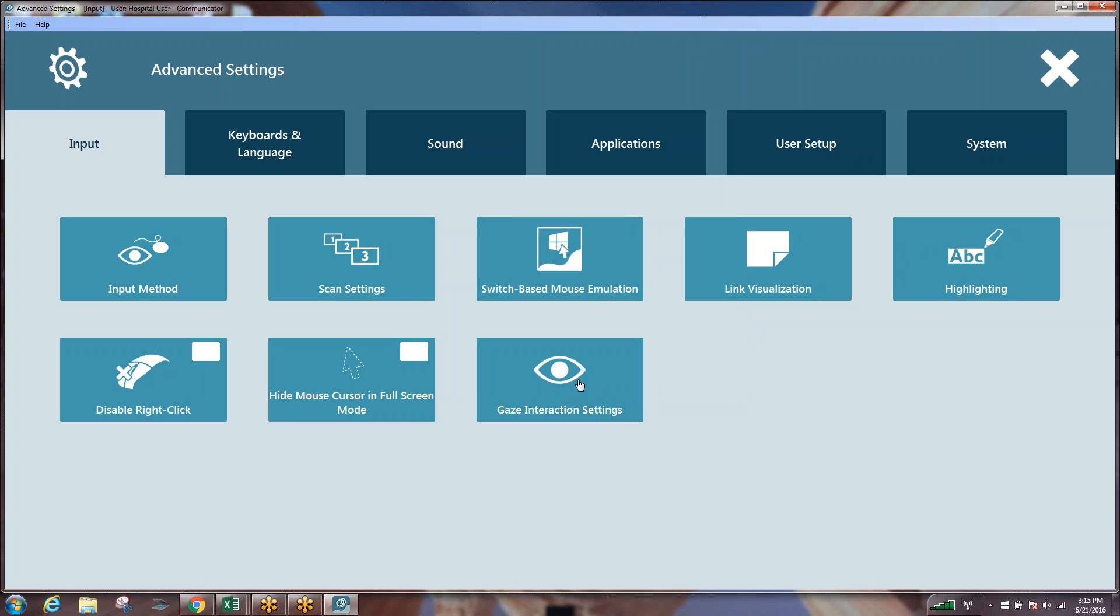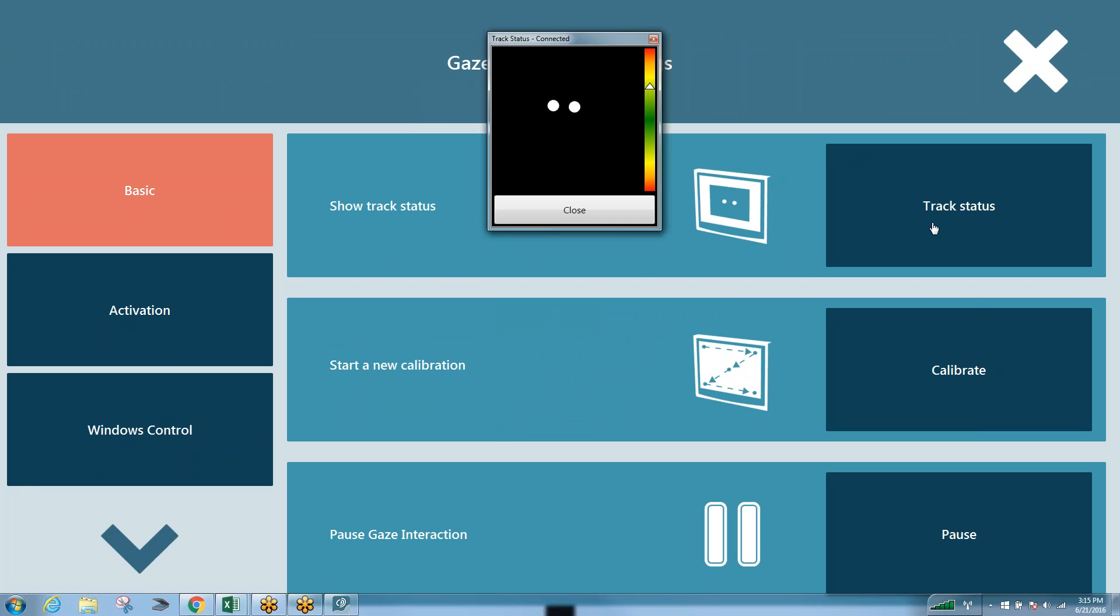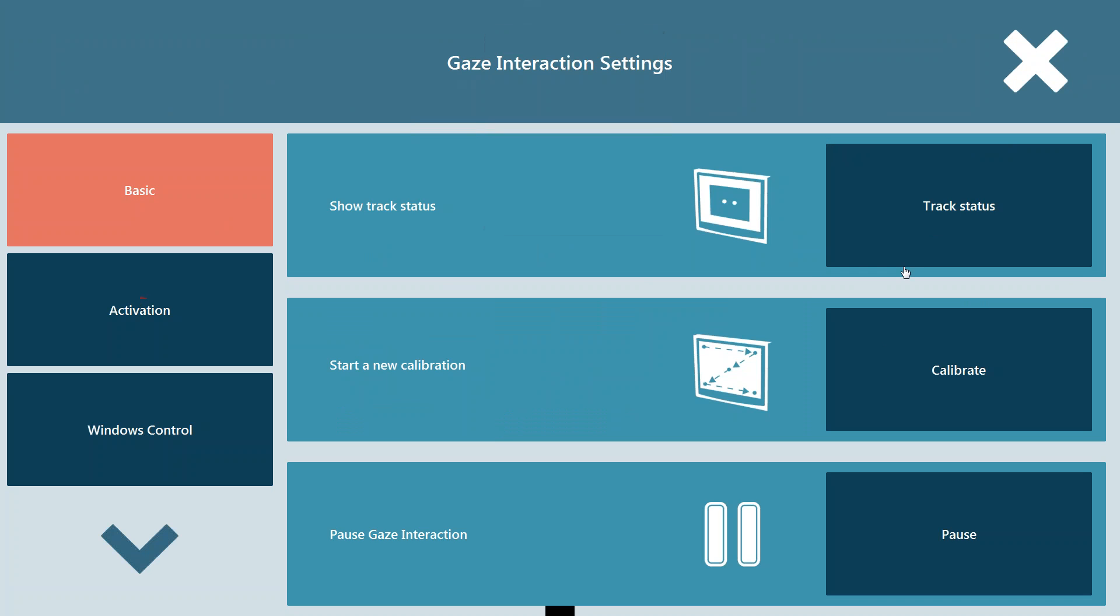Now we want to go into our interaction settings. When we go into our settings, what you'll initially see is the basic button will be highlighted on the left-hand side, and you'll be able to toggle on and off your track status box. You could start a new calibration from here, which we do not want to do at this time. Once we've gotten a solid calibration, we don't need to change that calibration unless something physically changes with the user. New glasses, glasses on or off, contacts in or out, that kind of thing. If that's the case, we would probably want to set up a separate user profile for each one of those situations rather than doing a calibration every time something changed. What I mean by that is I personally wear contacts and glasses. I would set myself up with one user with glasses and one user with contacts, and I would calibrate myself separately for each one and then toggle back and forth between them when needed.